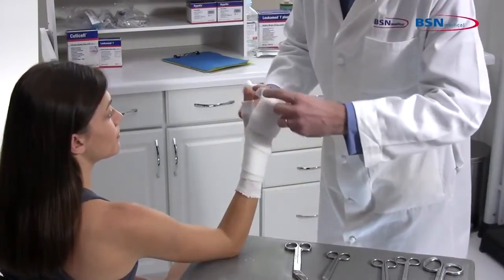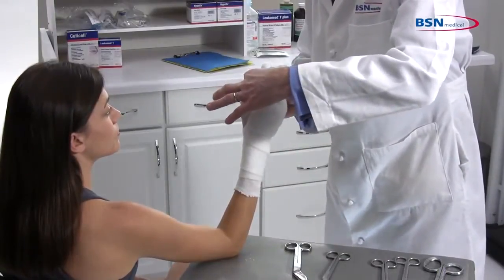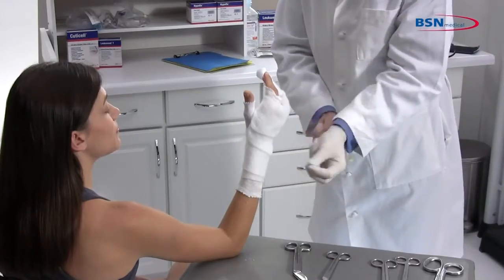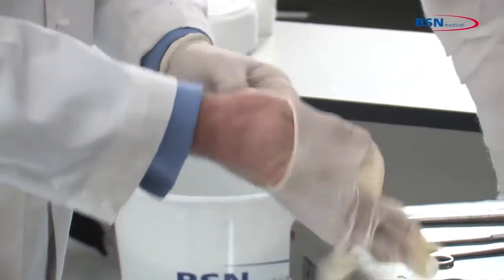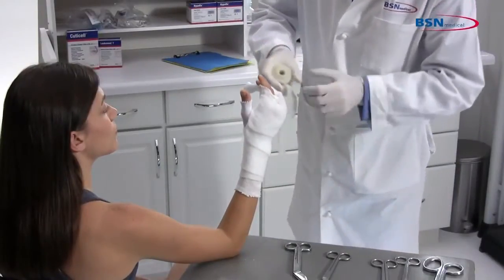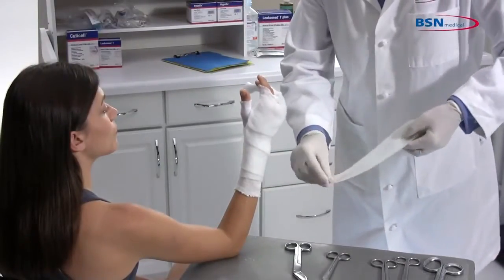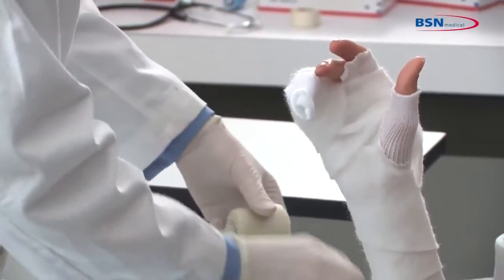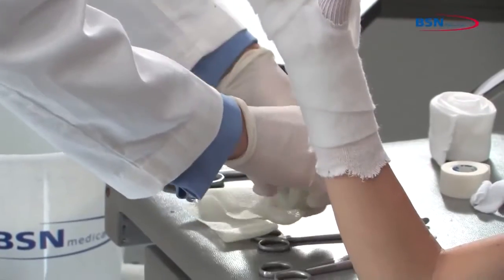Make sure the patient's limb position is correct before starting to apply the cast tape. Begin by putting on protective gloves before applying the cast tape. Measure using the cast tape from distal phalange to wrist. Fold over two times to make three layers, cut, and reserve to the side to be used as a reinforcement strip.